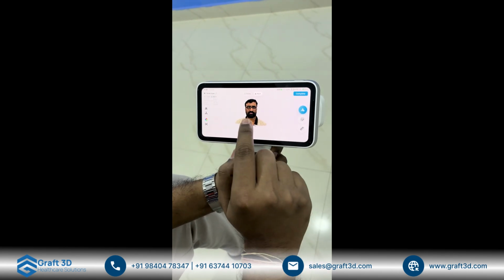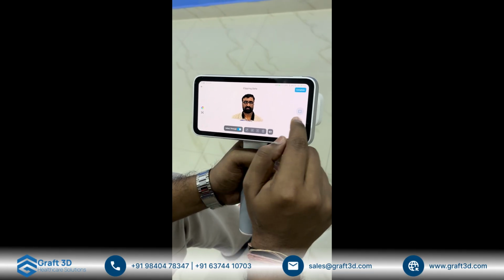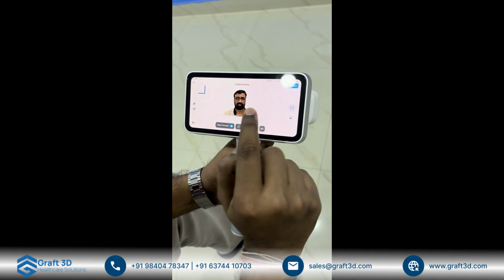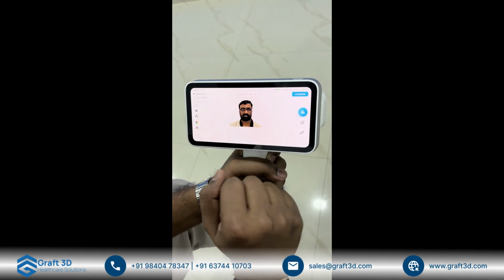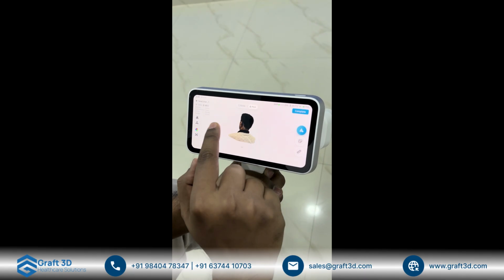Once this is done, if you want to edit some part, I can just take this particular region, select it and delete it. This is like selecting the mesh data now. Okay, click on complete. Now we can just check the quality of the data.